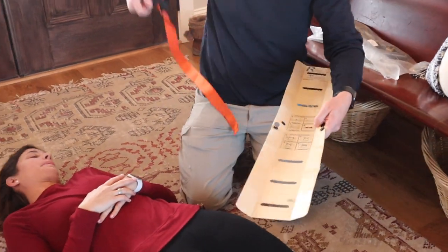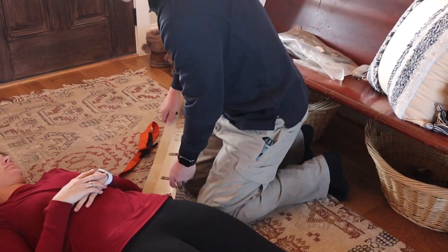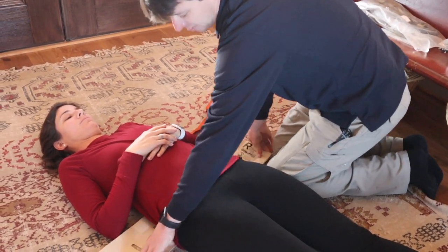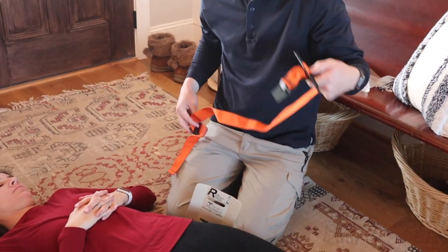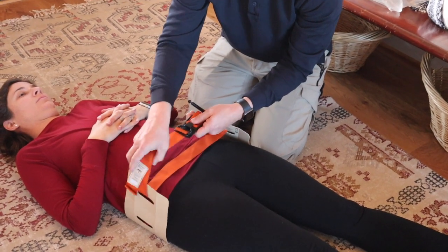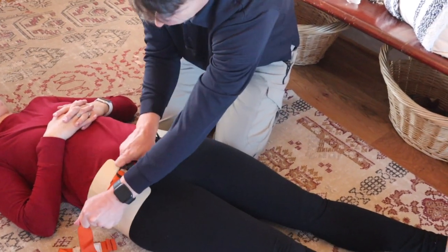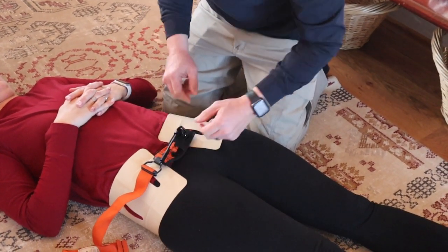To make this a pelvic binder, we're going to use a Soft T tourniquet and the new RISE splint. The easiest way is to slide it in from the small of the back and then move it into position. We've got the splint in place, run our tourniquet through here, secure it back, tighten it up, and we have a pelvic binder.